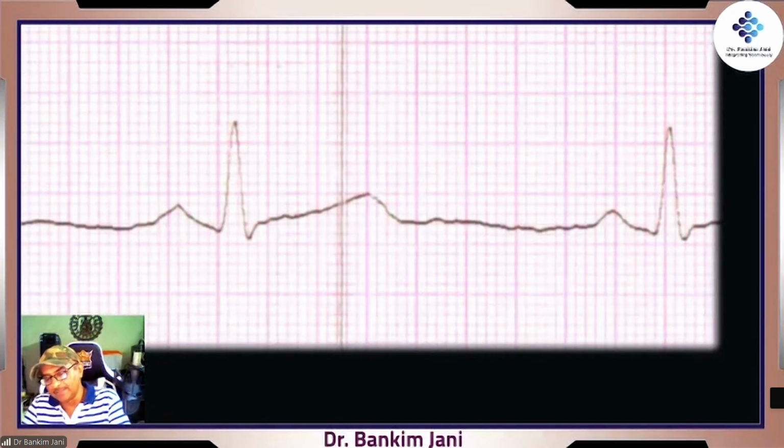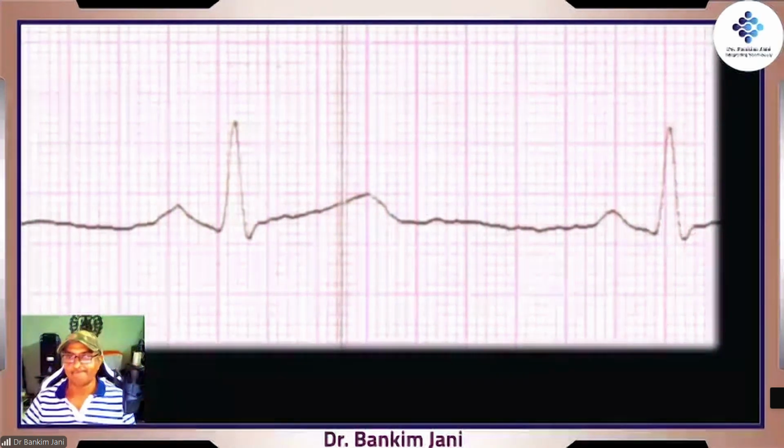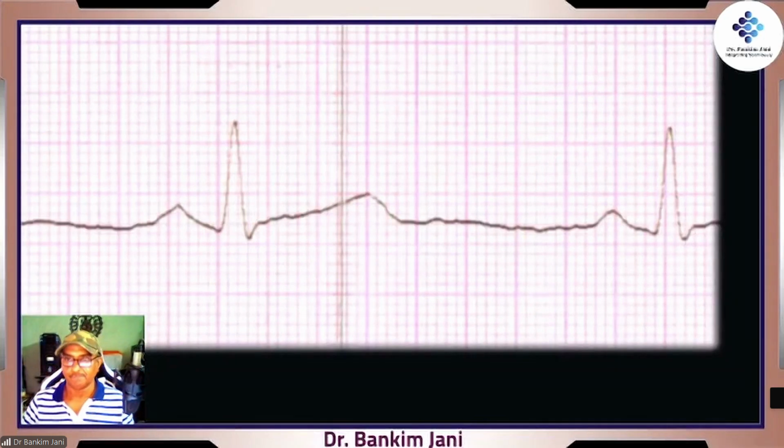The formula is 300 divided by big boxes between 2 waves, or 1500 divided by small boxes. Correct. So that should be the answer, around 36, exactly 35, 36. Correct. Because the beat would always be in that number range. So everyone, around 35, 36, you are right.